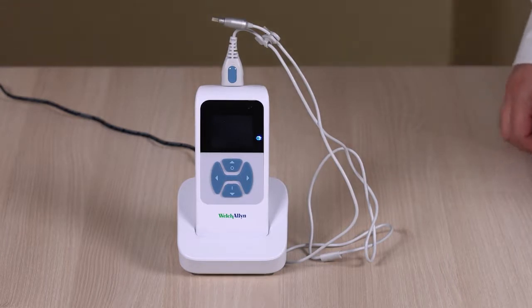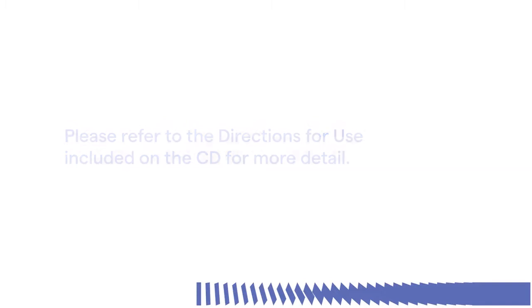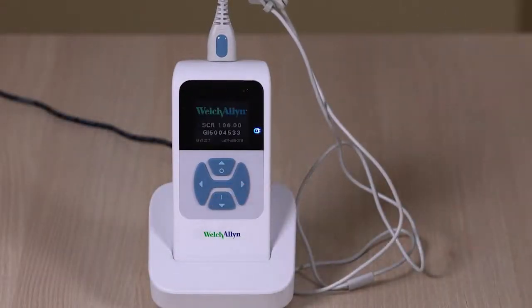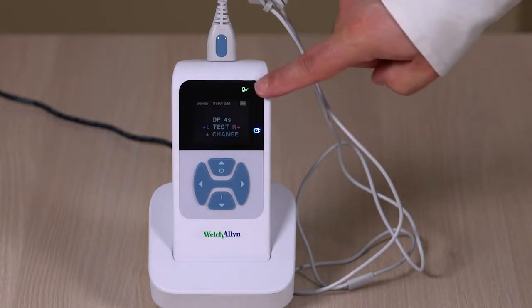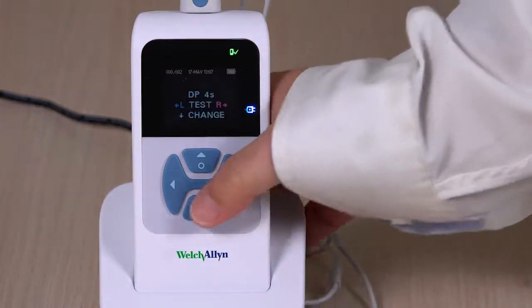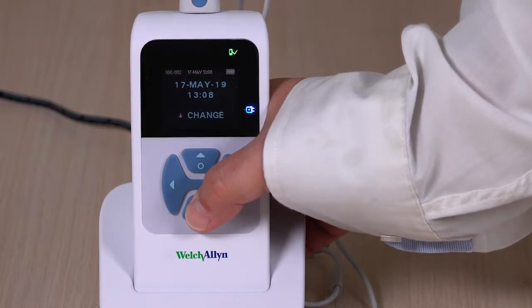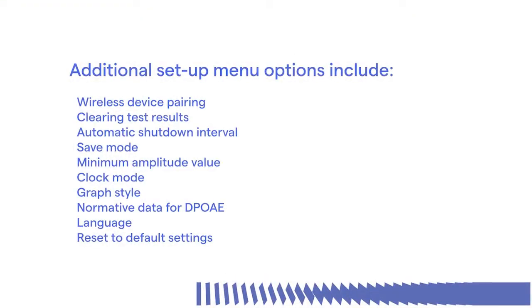Now that the device is set up and charging, here's a brief overview on navigating the screening setup features. Please refer to the directions for use included on the CD for more detail. To turn the device on, press the down button located below the screener's display screen. The green ready light remains constant, indicating that the screener is ready to use. To access the device settings menus, press the down arrow until the date and time menu appears, then press the change arrow and hold until the green light blinks. Additional setup menu options include wireless device pairing, clearing test results, automatic shutdown interval, save mode, minimum amplitude value, clock mode, graph style, normative data for DPOAE, language, and reset to default settings.